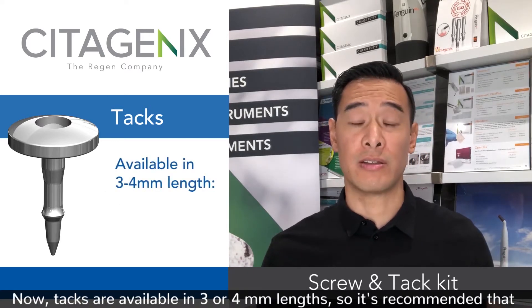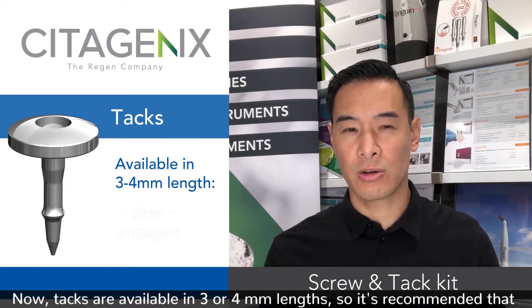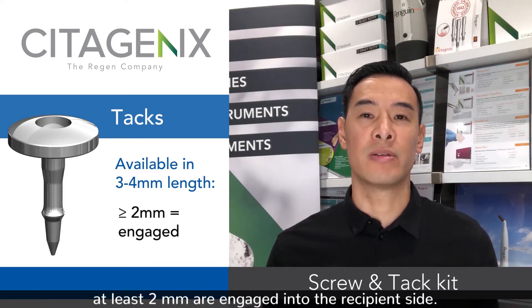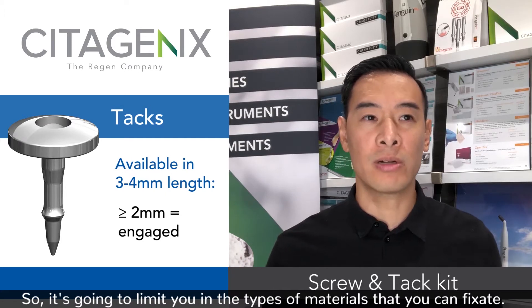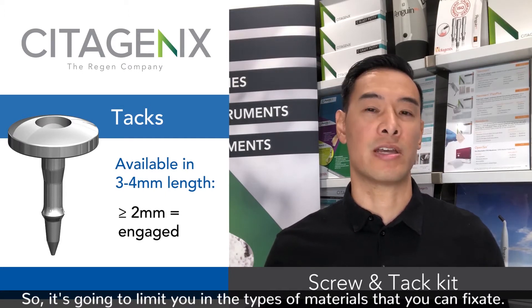Tacks are available in three or four millimeter lengths, so it's recommended that at least two millimeters are engaged into the recipient site, which is going to limit you in the types of materials that you can fixate.